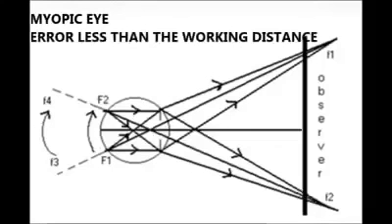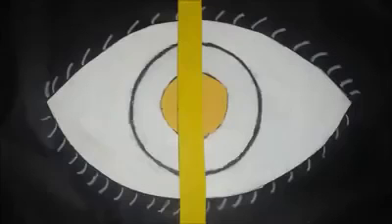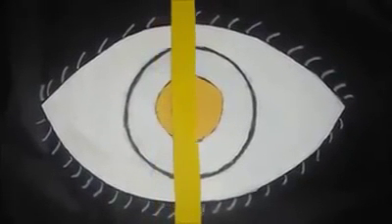In myopia, less than 1 diopter, the light rays emerging out of the eye are convergent and meet at a point F1 and F2 behind the observer sitting at 1 meter. The movement is along that of the plane mirror, that is, with movement. Sometimes we notice a neutral reflex.